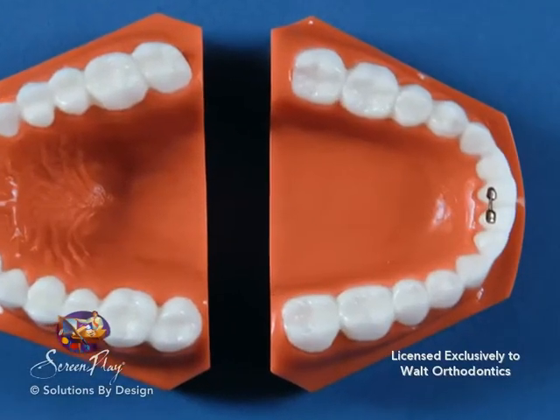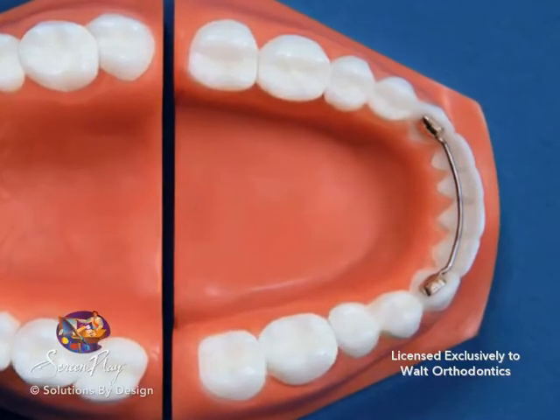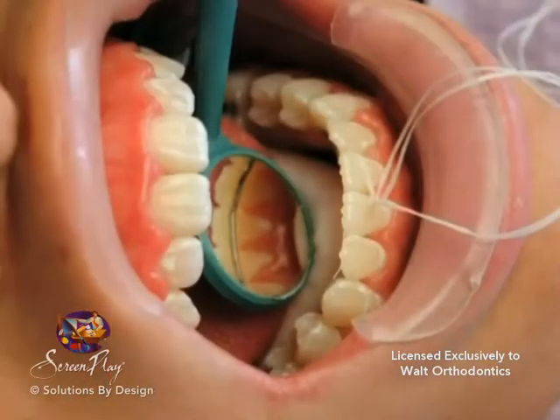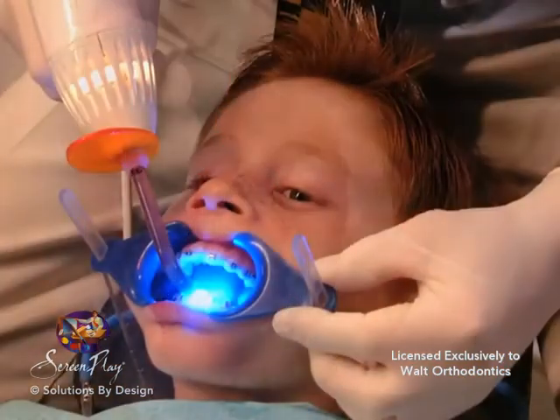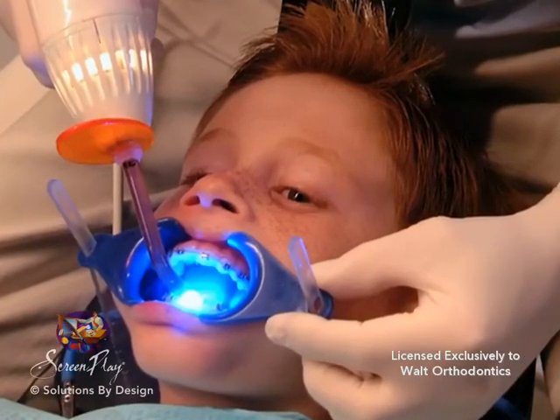A fixed retainer is an orthodontic appliance that can be permanently placed in the mouth to hold teeth in position after braces have been removed. A fixed retainer is typically applied to the lingual or backside of the lower teeth. This type of appliance is cemented in place and secured with a curing light, which activates the bonding agent in the cement.